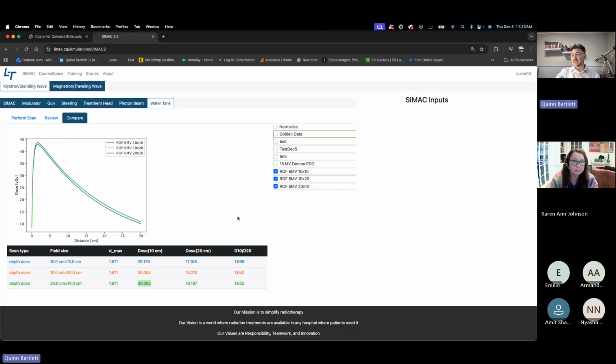So that's what we can do. And like I said, that extends to any machine and any energy.